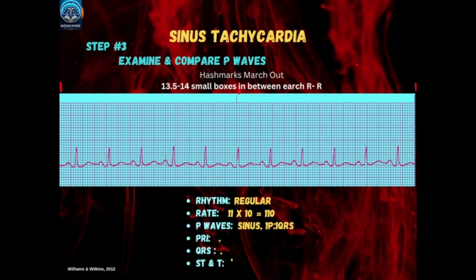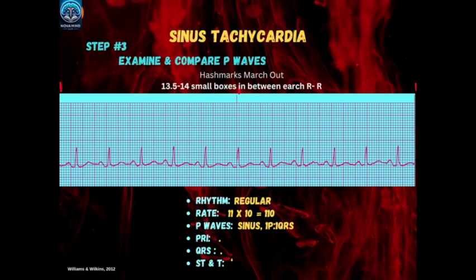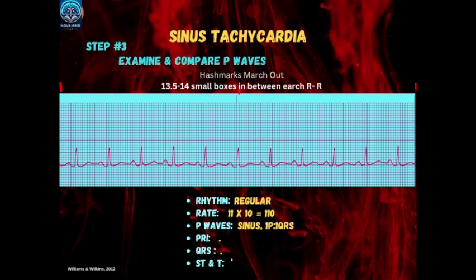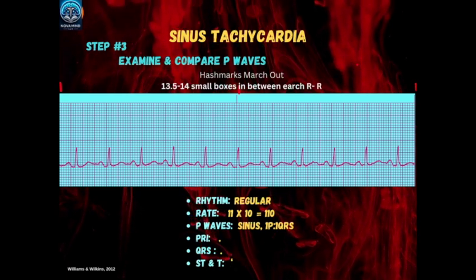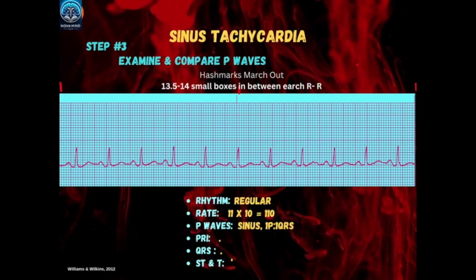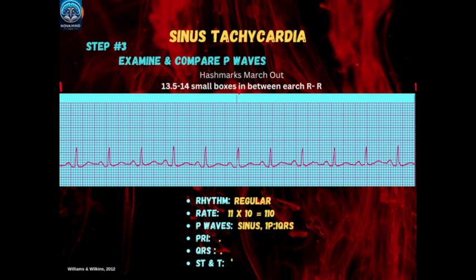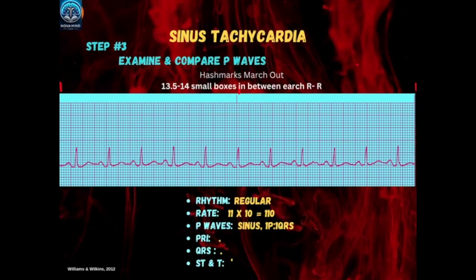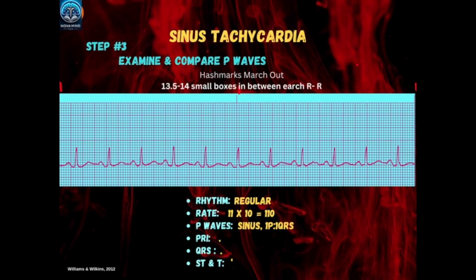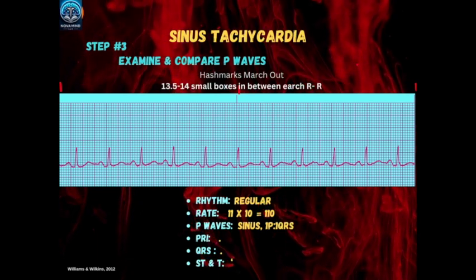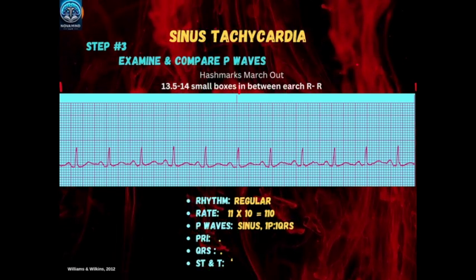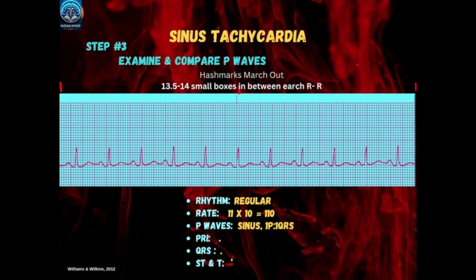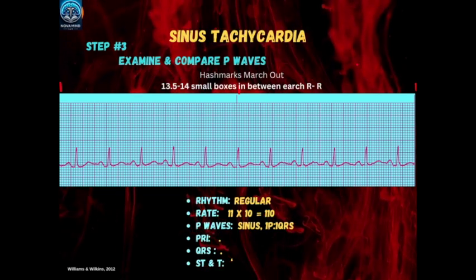In step 3, we examine and compare all P waves. The P waves in the strip are upright and positive in lead 2, which is a hallmark of normal electrical conduction originating from the SA node. The P waves are smooth, rounded, and maintain a uniform shape throughout the entire ECG strip. This uniformity indicates that the electrical signals are consistently generated by the SA node. In sinus tachycardia, just like in normal sinus rhythm, each P wave is followed by a QRS complex, confirming proper conduction from the SA node. The P waves are confirmed to be sinus P waves, indicating the rhythm is being driven by the SA node.